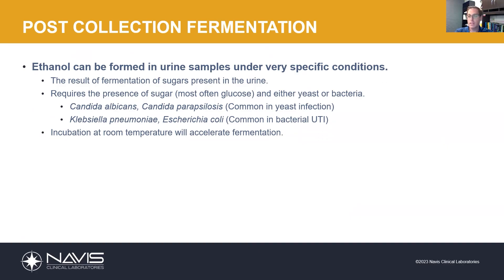The first thing we need to discuss is a phenomenon known as post-collection fermentation. This refers to the fact that ethanol can be formed in urine samples under very specific conditions. This is the result of fermentation of sugar that's present in the urine — and that's where diabetes comes into the equation. In diabetics, in many cases, they're producing urine that's loaded with glucose. They're not controlled and they're excreting glucose into their urine. There's our sugar source.